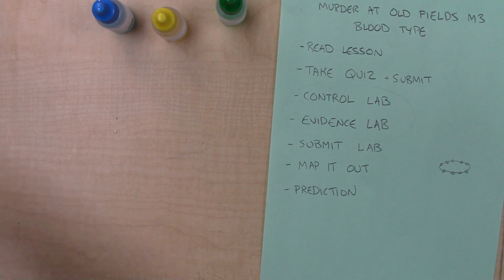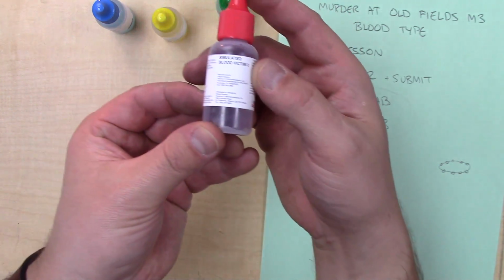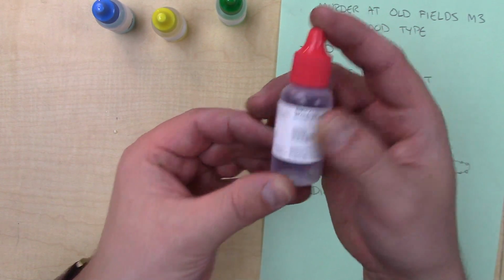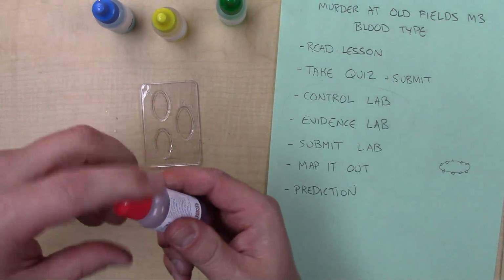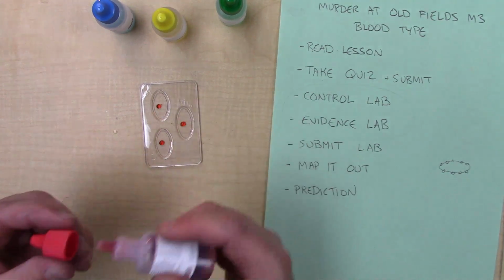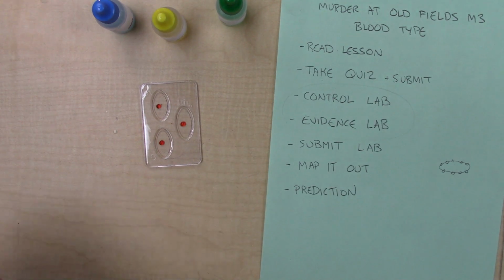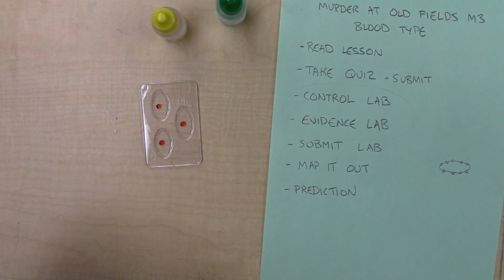Here we go. Victim 2, that is Rebecca Smith, the wife. She died. So we're going to look at Rebecca's blood. We'll take a tray here. We will go a drop for A, B, and positive or negative. We will test that out. Let's take an A test.